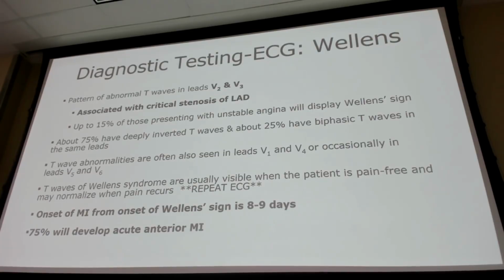And so we look for these deep T waves or abnormal T waves in V2 and V3, and this is associated with critical stenosis of the LAD. So when we see this in a patient, we want to increase our spidey sense. So, okay, they're not having a STEMI right now, but they have a very high chance that they're going to have one in the near future.